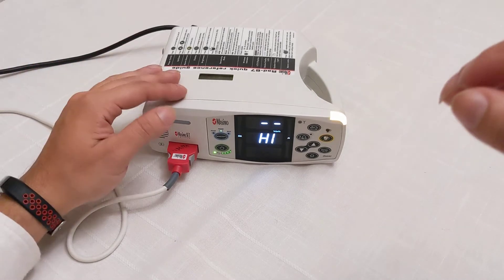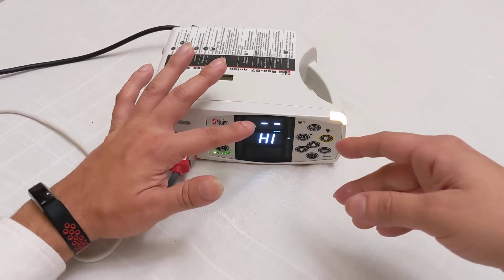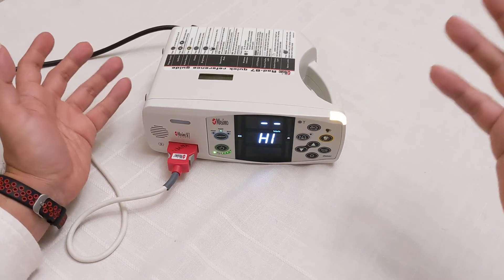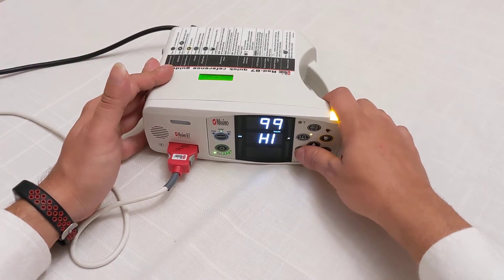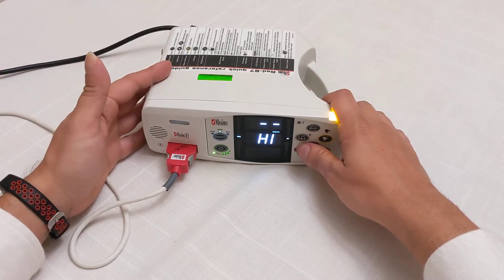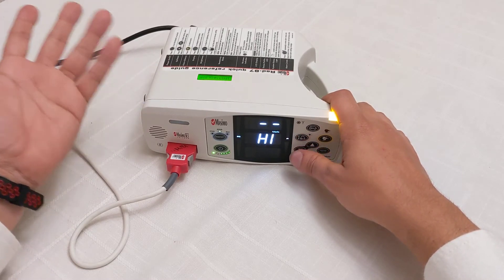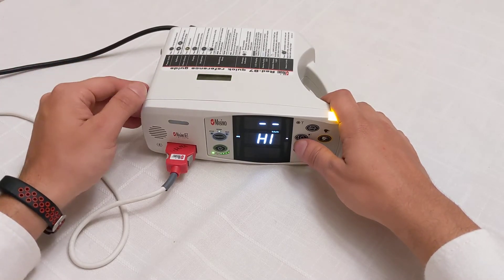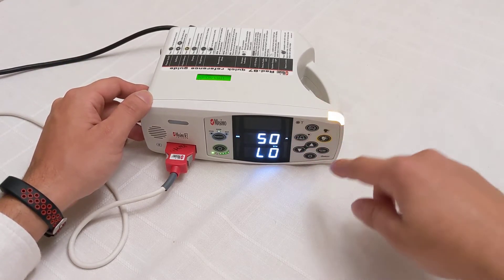The next button is to adjust the high SpO2. On this machine it's set to infinite because we don't want it to ever beep if SpO2 is high — if it's high, it's good. You can adjust it if there's a certain percentage you don't want it to reach, though that's a bit unusual since the highest it can go is 100%, which means oxygen is reaching your fingertips perfectly.